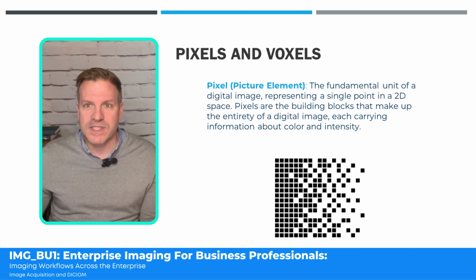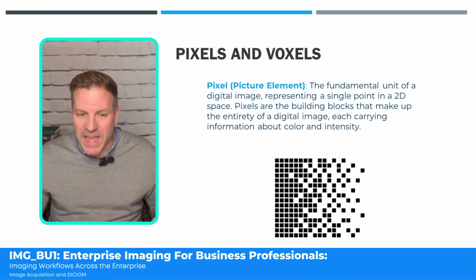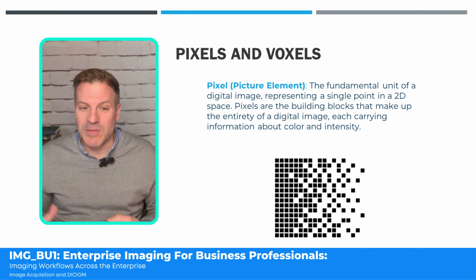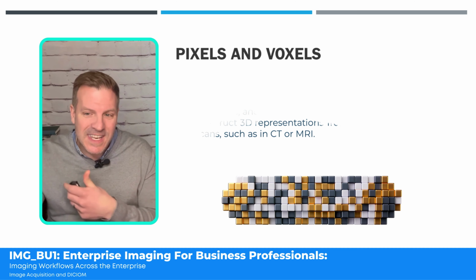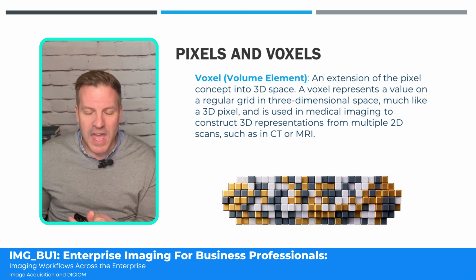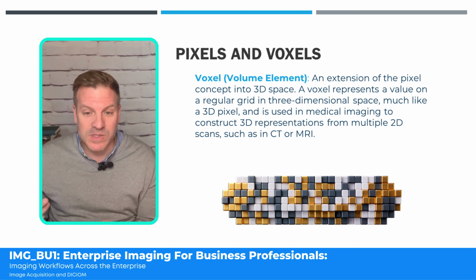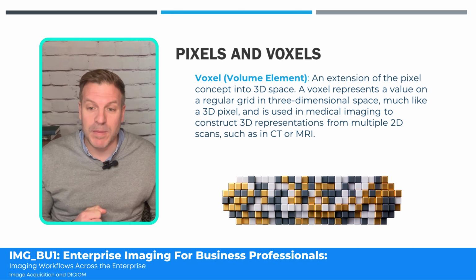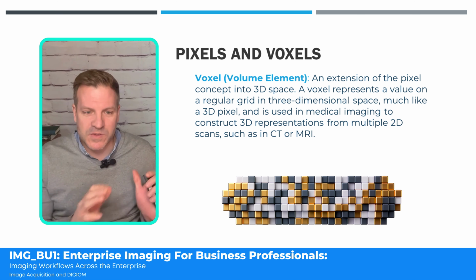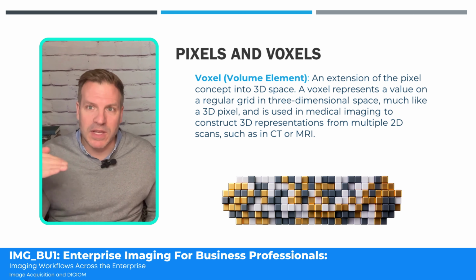If we think of this in the context of medical imaging, we would have each individual pixel making up the entirety of a digital image, like a building block, so to speak. Now, the voxel is an extension of this pixel concept, but thinking of this from the 3D space. So the voxel represents values on a regular grid in 3-dimensional space, much like a 3D pixel. So we'll acquaint ourselves with this idea of pixels and voxels. And again, that idea of the building blocks of pixels.